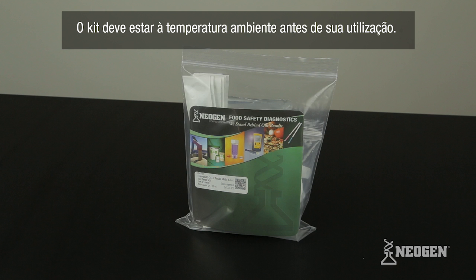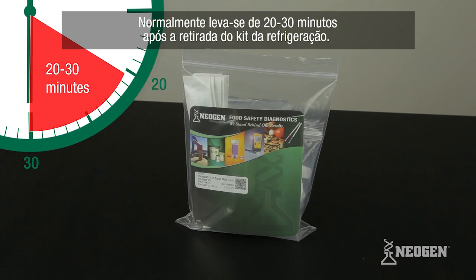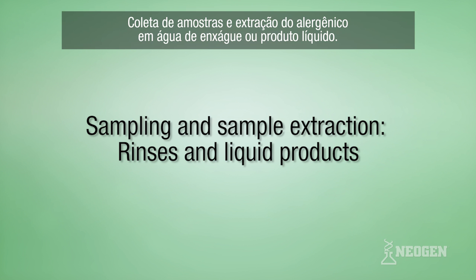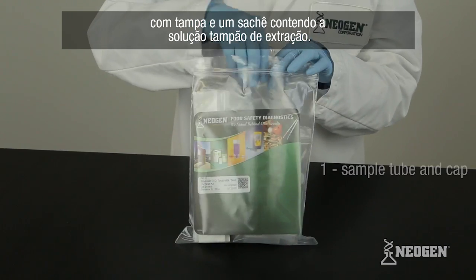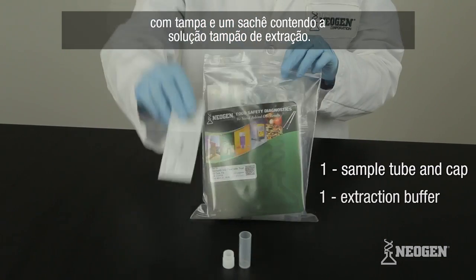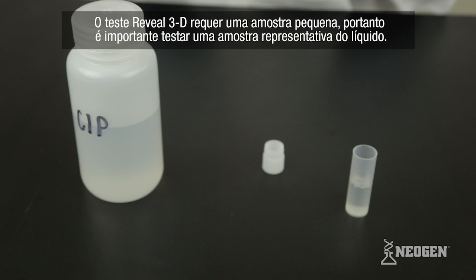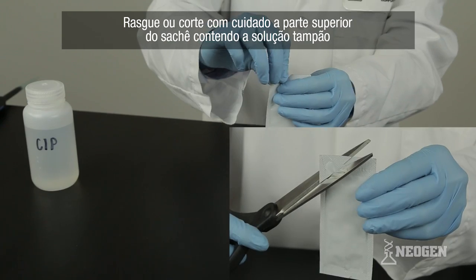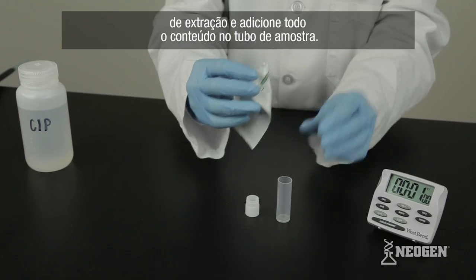Remove the test kit from refrigeration and allow it to reach room temperature before use. This generally takes 20 to 30 minutes. To test a CIP rinse or liquid product, remove one sample tube and cap and an extraction buffer. The Reveal 3D test requires only a small amount of liquid sample. Therefore, it is important to test a representative portion of the liquid. Carefully tear or cut off the top of the extraction buffer sachet and add the entire contents to the sample tube.